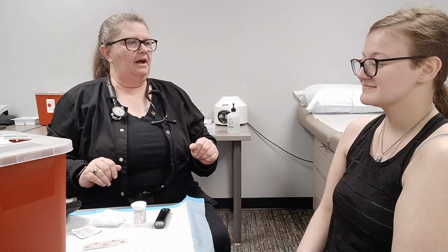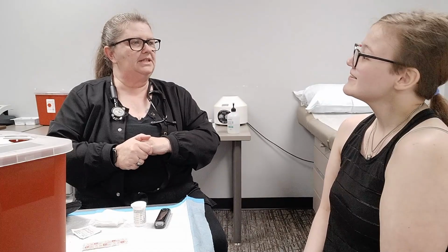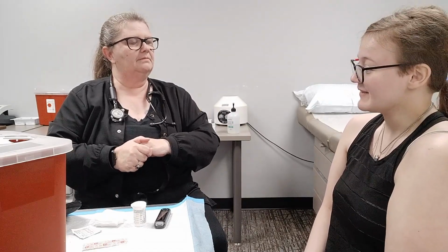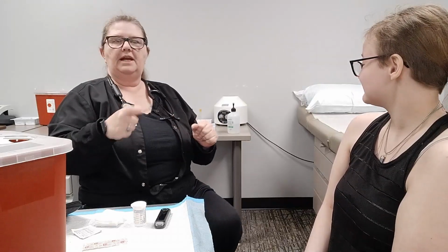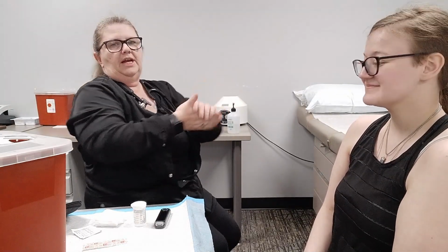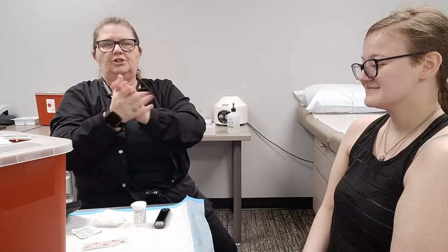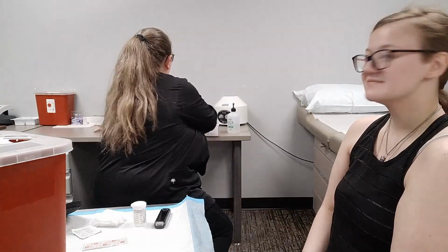Okay, and then we have our patient here. May I get your name and date of birth, please? My name is Penny Lane, and my date of birth is October 1st, 2000. Wonderful, that matches my requisition. So I'm just going to go ahead and wash our hands. Use some hand sanitizer since I'm not near a sink. All right.